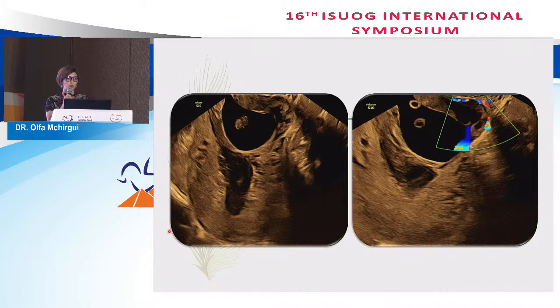The ultrasound showed an empty uterine cavity, a low-lying gestational sac with positive cardiac activity, and the Doppler mode here showed abnormal hypervascularization between the bladder and the myometrium with bridging vessels.